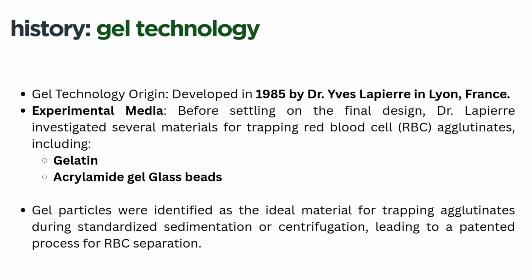And initially, Dr. Lapierre experimented with a variety of materials, including gelatin, acrylamide gel, and glass beads. And this experimentation was crucial for finding the most effective medium to trap red blood cell agglutinates. And ultimately, gel particles were chosen for their superior ability to facilitate standardized sedimentation and centrifugation. And this led to a patented process that revolutionized RBC separation.